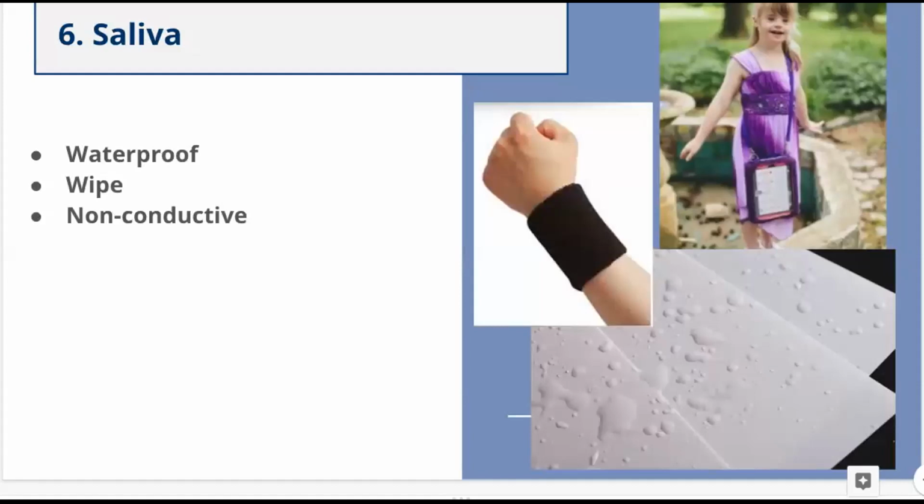Another one that happens a lot, life happens, saliva can be really impactful now that most of the high-tech devices have moved to a conductive screen. Conductive screens do not appreciate wet fingers. They do not like drool. And if you have a wet spot somewhere else on your screen when you're activating, the activation will not occur.